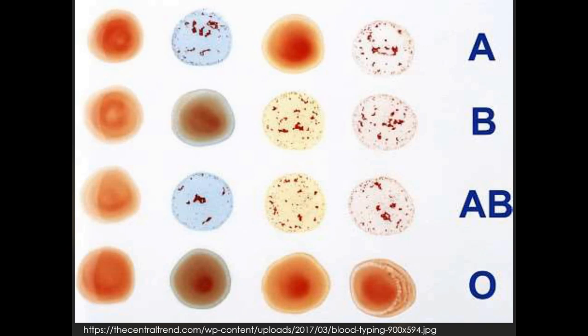On B, what should I put? Not just B, but positive. B positive. What about AB? It's also positive because this is where it's positive. What about O? Negative. It's negative because it didn't get a result like that. Sometimes you'll get these rings going like this and it'll look like a reaction, but that is just the blood evaporating.